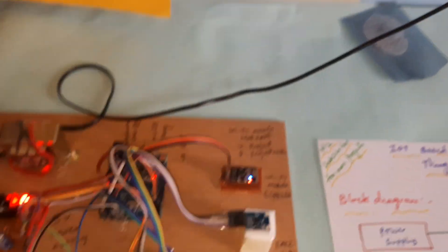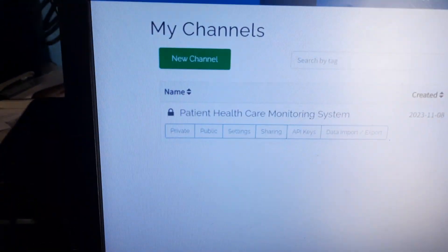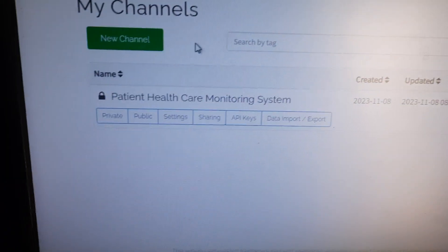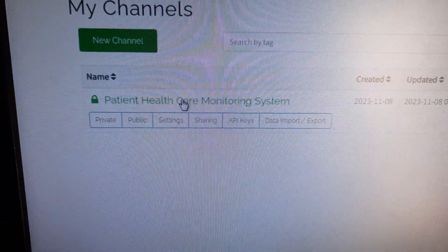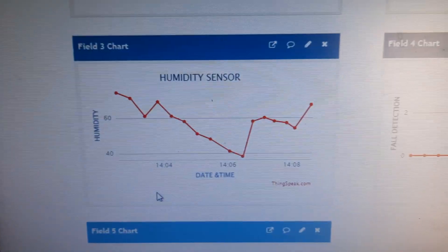Inserting power onto the power supply board now. The system displays a login page showing body temperature, heartbeat, humidity, fault detection, and ECG — all sensor data is displayed on the LCD.